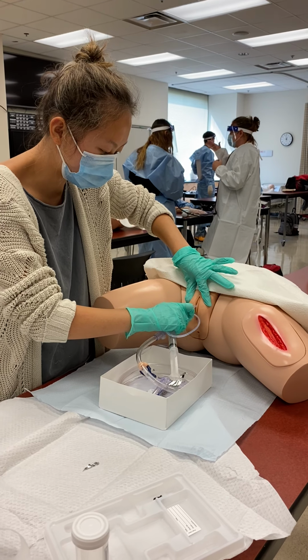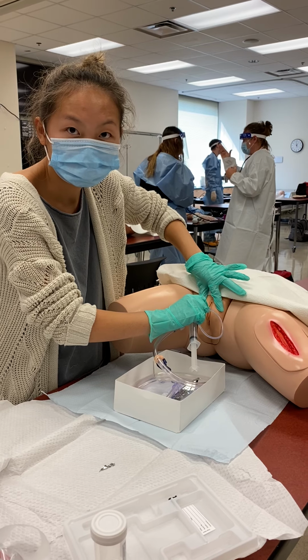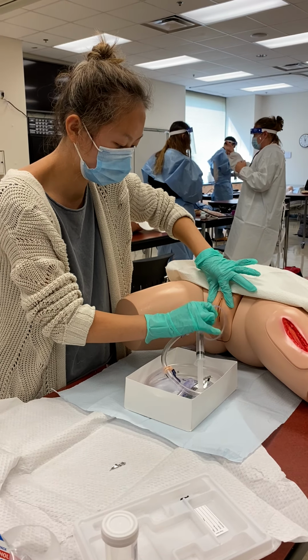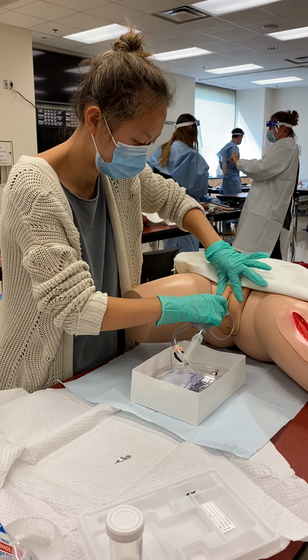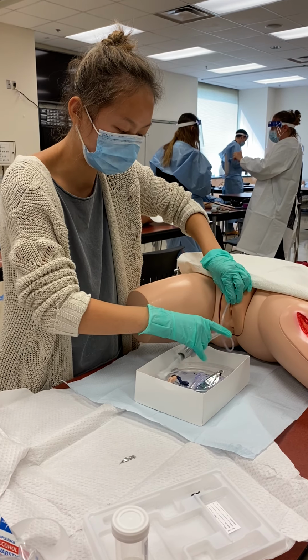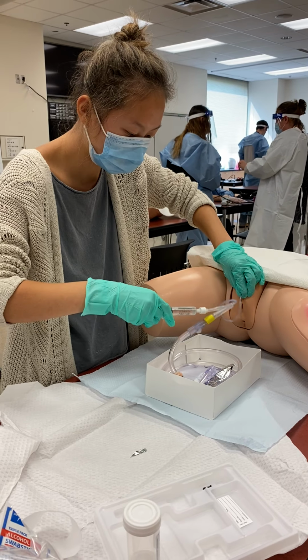So we're going to insert this tip in. And so you're going to see urine come out from the patient. And if that happens, you want to insert it a couple more inches into the patient. And so I can hold the catheter with my non-dominant hand now and inflate the balloon into the patient.